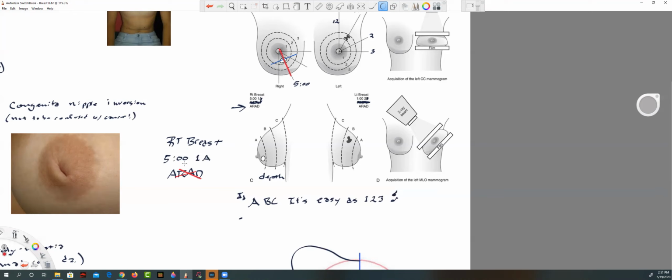It's not going to change its clock position. The 1 is not going to change. The depth isn't going to change, but my transducer changed. And so now I put RAD because my transducer is in that position. So realizing now what they were doing over here, they were looking at both pictures, and I'm an idiot.